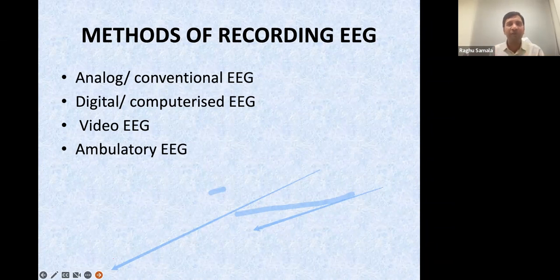Are these waveforms representing any deep structures? No. Are these waveforms representing the basal and the medial structures? No. So you are recording only from the surface and it represents the pyramidal neurons, and you are recording the postsynaptic potentials at the dendrite level. I think this much is enough. If somebody asks you what you are recording, we are recording the electrical activity from the pyramidal neurons.